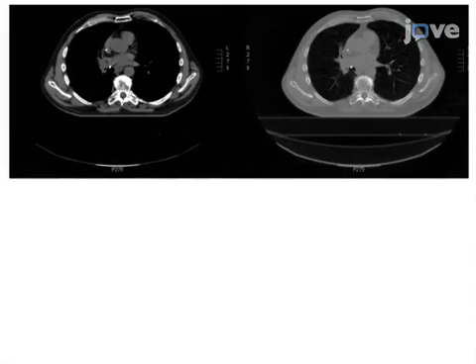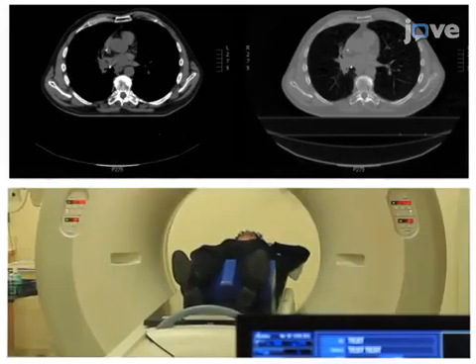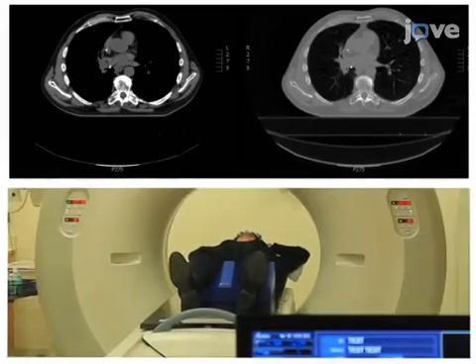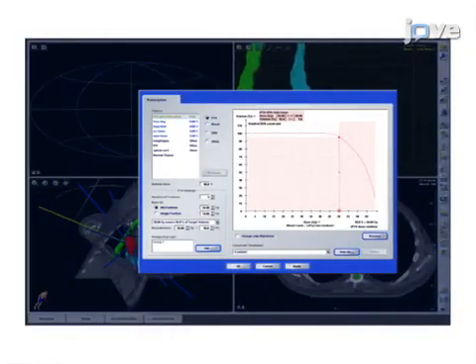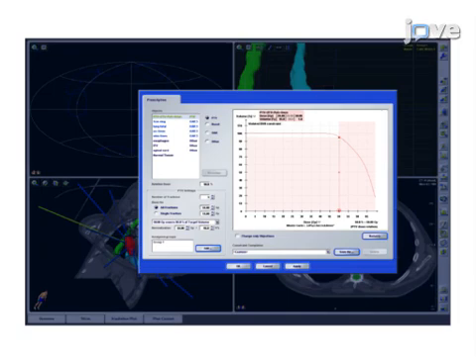Then, CT-guided simulation, physician contouring, and radiation dose planning are carried out. The final step is to build a respiratory correlation model and initiate dynamic tracking radiation treatment. Ultimately, dynamic tracking during stereotactic ablative body radiation therapy is used to treat moving lung tumors with therapeutic radiation dose and with minimal toxicity.